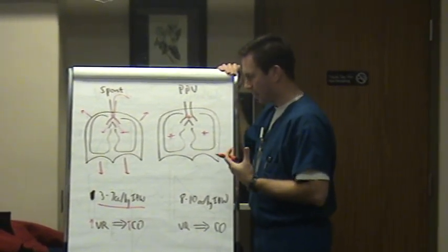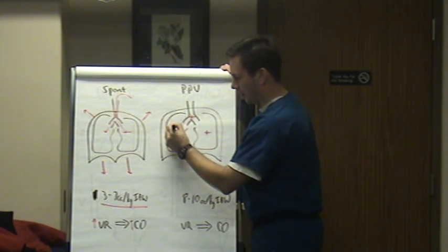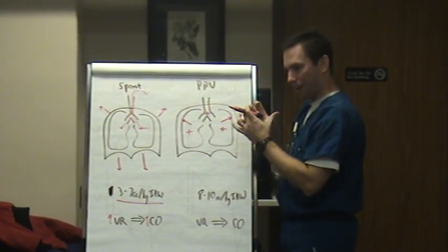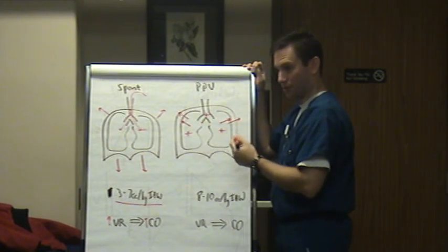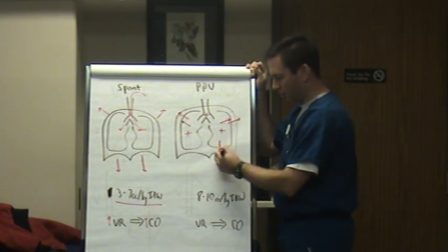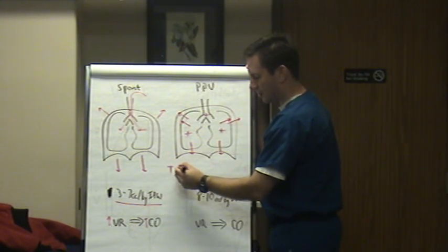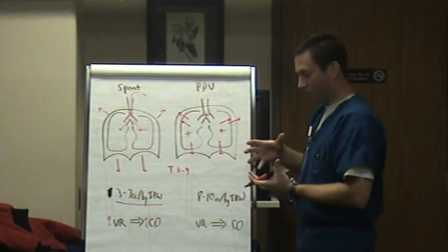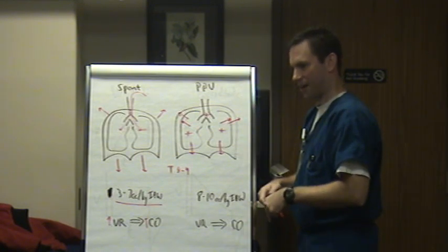So you're telling me that if I walk up to the bedside and you're on a ventilator and I see your chest rise and fall, that I have to understand this is what's happening. I'm inflating this lung to the point that I'm taking soft tissue of the lung and expanding it enough that I'm actually displacing a skeletal structure. You agree, we're pushing the rib cage out. Not only are we doing that, but we look at x-ray too to make sure we're giving you a nice breath. We look to make sure that we have pretty fair diaphragm excursion, usually around T8 to 9 is where you want to look on x-ray for your diaphragm. So we agree that we are giving this patient enough positive pressure that we're making the chest rise and displacing the diaphragm, right?